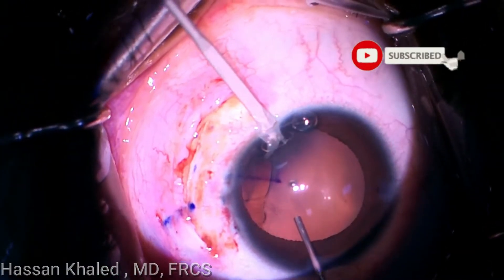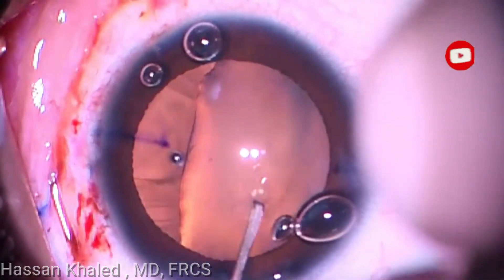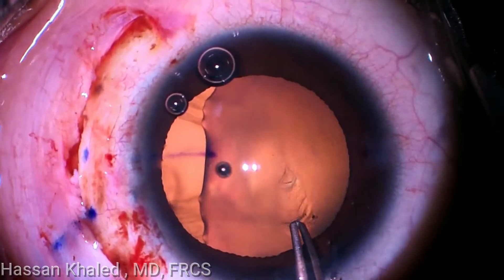Filling the anterior chamber with dispersive OVD. Then a cystotome is used to create a flap in the anterior capsule, and a well-sized capsulorhexis is done.